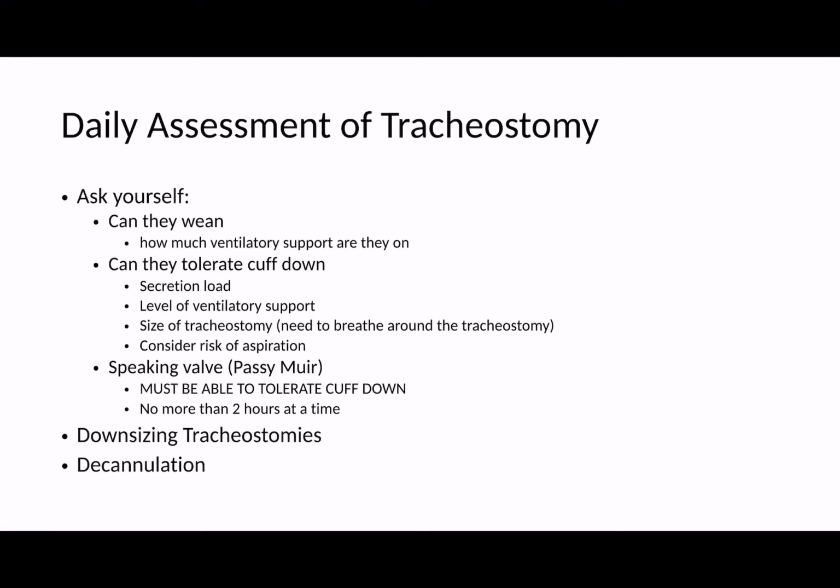You can also consider whether to put a Passy Muir valve on. Now, to be able to tolerate a Passy Muir valve, they must be able to tolerate cuff down periods. So if the patient can only tolerate half an hour of cuff down, there's no point in putting a Passy Muir valve on, because you've already increased the resistance through the circuit by having that valve in place.